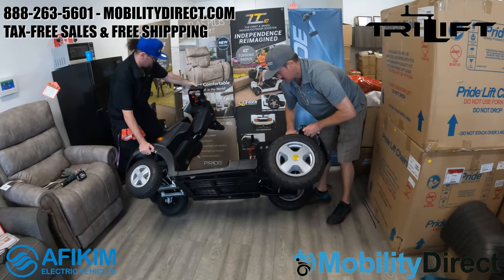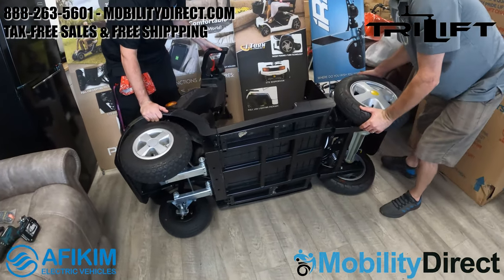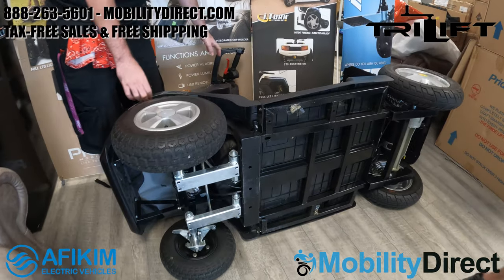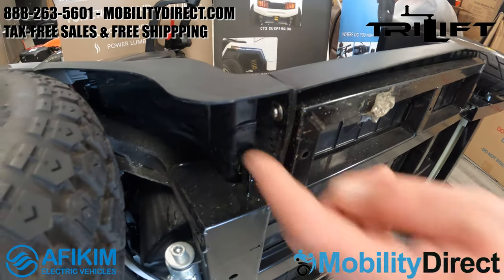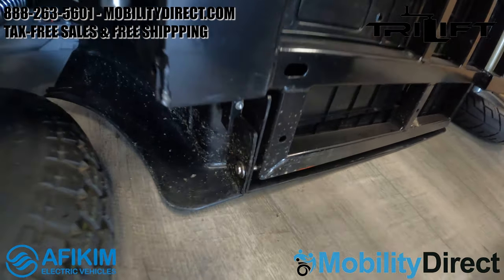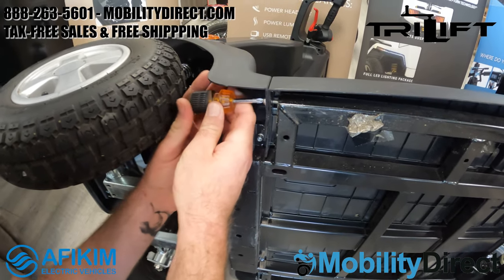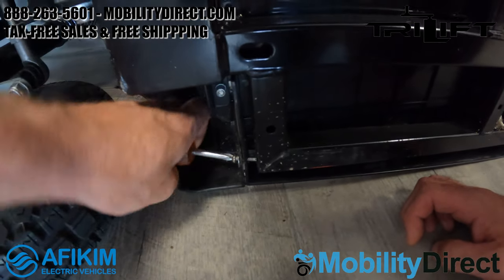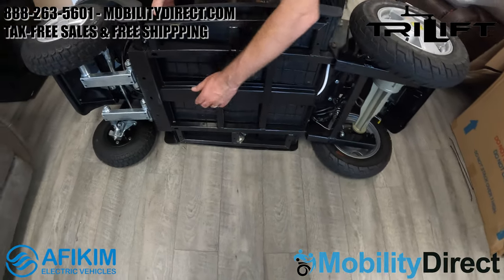When you tip the scooter over, it will help to have a second set of hands — it is very heavy. It's also very helpful to have a 90-degree drill bit to get into tight places. You're going to need to remove two screws that are pointing forward, behind the front wheels. A very short stubby screwdriver can work manually, but it's very difficult. A 90-degree drill bit is highly recommended to make the job a lot easier.